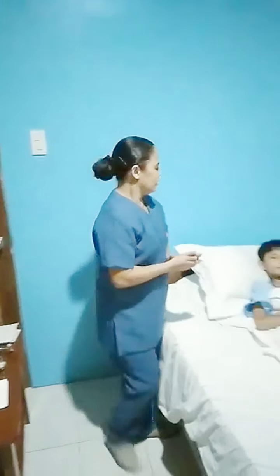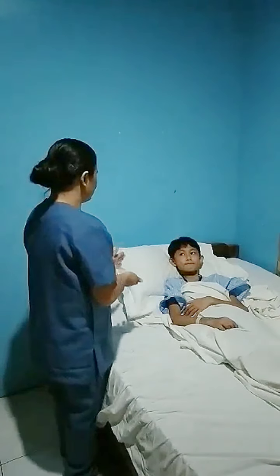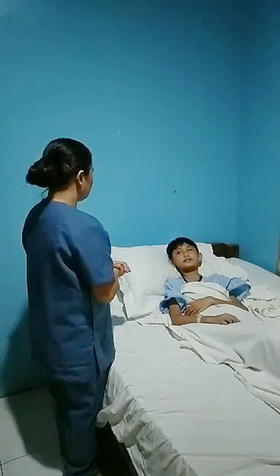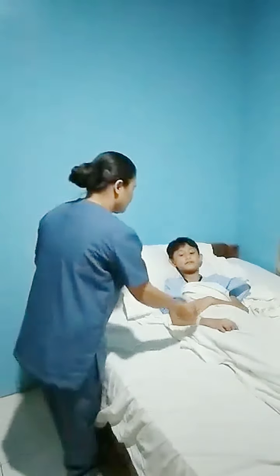For the implementation, first identify our patient, introduce yourself, and get the complete name and birth date of our patient, plus verify it by checking the wristband. Good morning, Sir Ryan. I am Rangas. I'll be your caregiver for today. May I know your complete name and birth date, sir? My name is Ryan Perez. My birthday is December 14, 2010. Thank you. May I check your wristband?